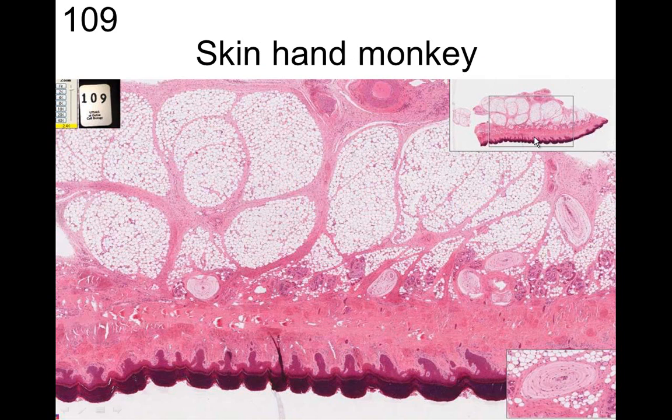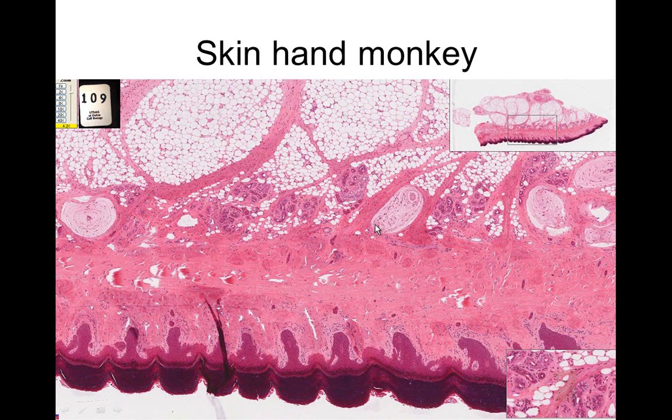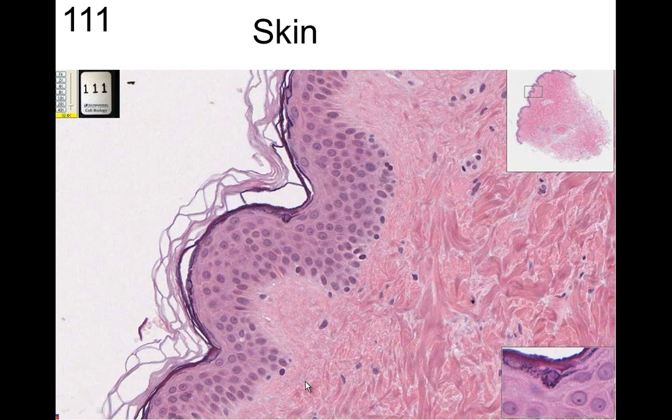Here we can see the finger pad, stratified squamous epithelium, non-vascularized, you see, which gets its nutrients from the connective tissue below. Also in there we can see the sweat glands. These are the sweat glands that dump their content on the surface to leave your fingerprints.